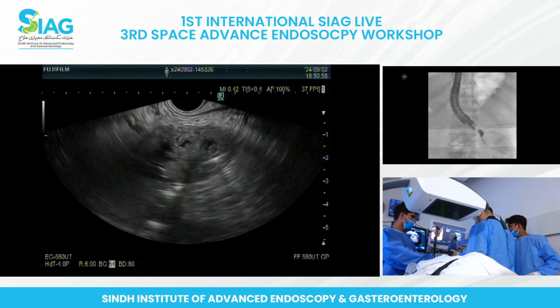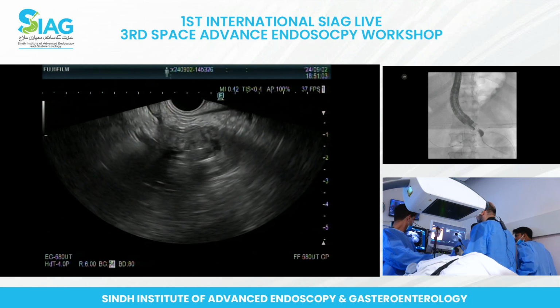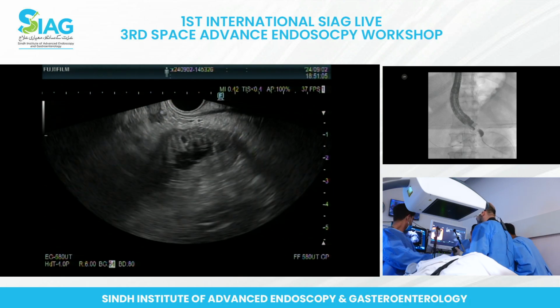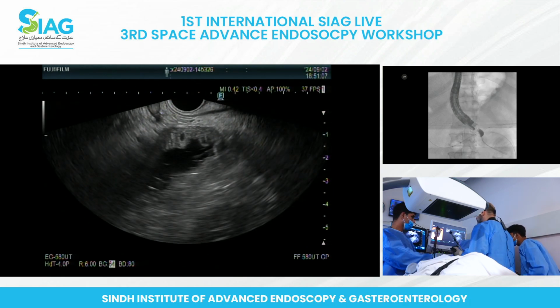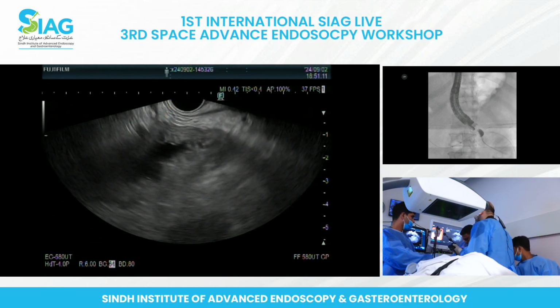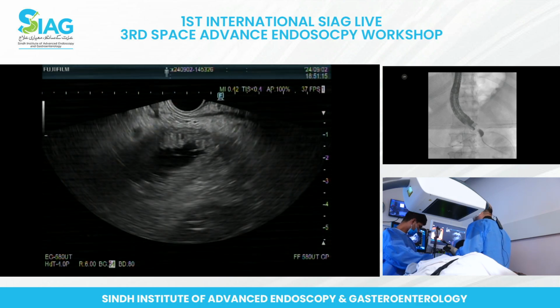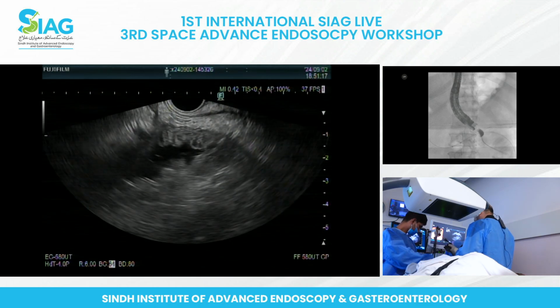So it just so happened that we had the 15 first, so our learning curve was on the 15. And patients do just fine with the 15. But now that we have 20s, we go with 20s. There may be some data to suggest 20 is better, but most people will do just fine.